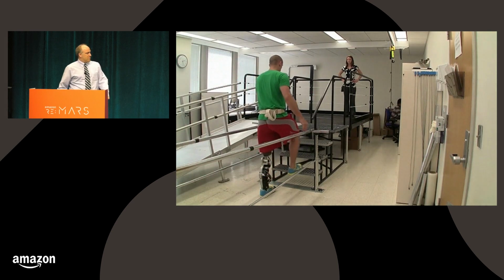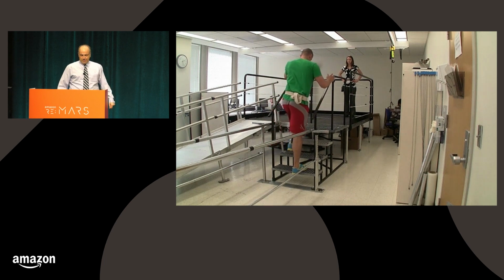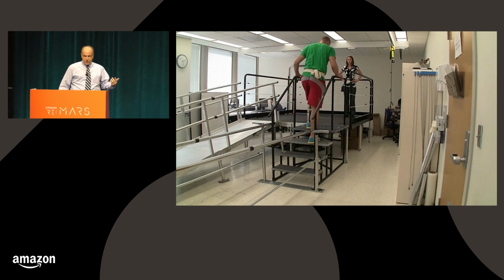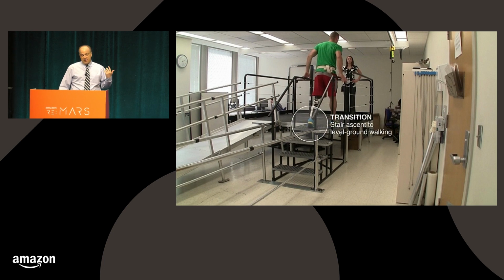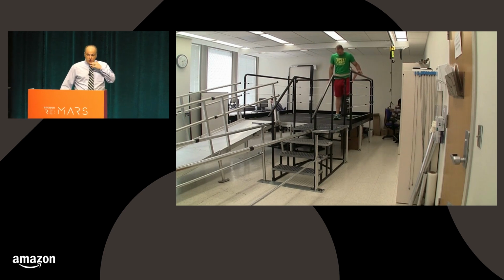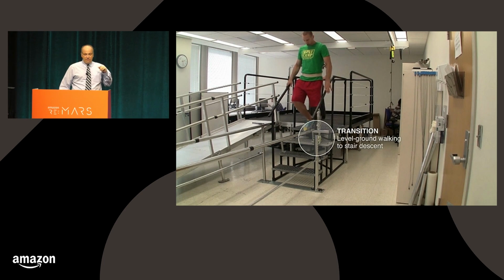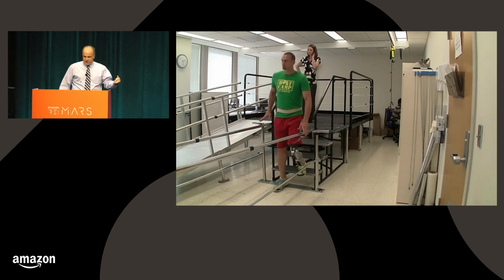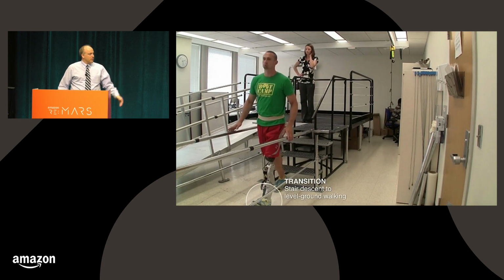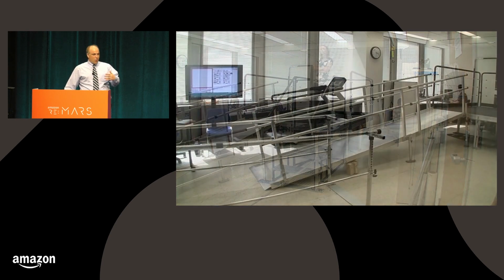So in this situation at the bottom of the step, if it didn't transition, it would kick the stair and you'd be unable to climb the stair. But because it did transition, his trajectories change, he can ambulate. If it doesn't transition back to walking, it's potentially going to hold the leg up in the air and not be in a position to bear his weight. So those are key points in the gait cycle where we have to be very reliable. If it didn't transition here, he would jackknife over the leg because it was too stiff and potentially fall down the stairs. If it didn't transition here, it would be too compliant and it would feel like he's walking in a hole.